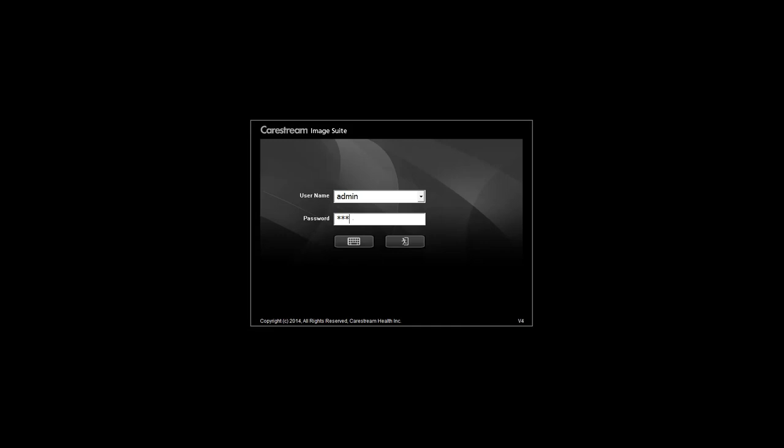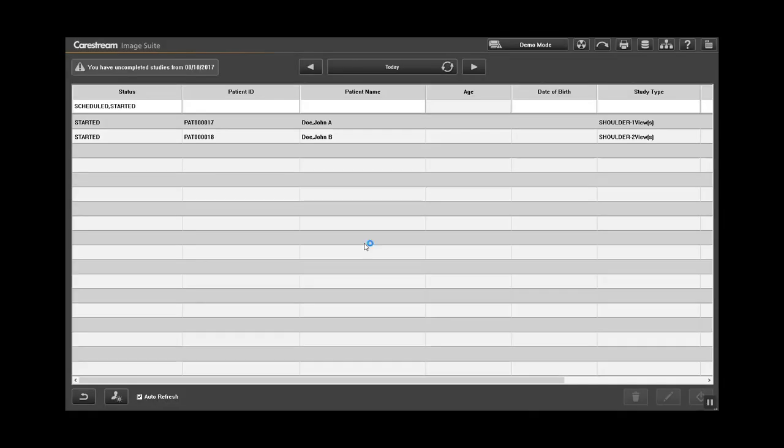Log on to the system using your username and password, and then press Enter. In the toolbar, select Local Archive Status.